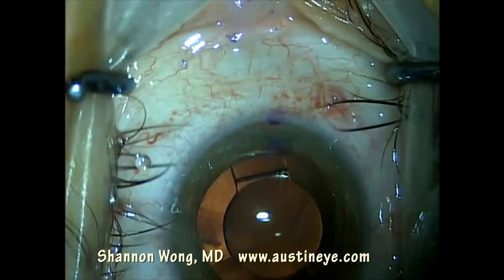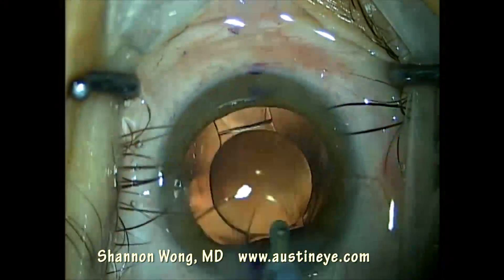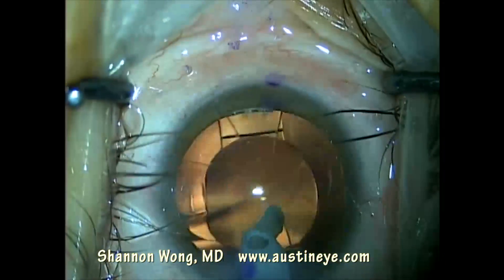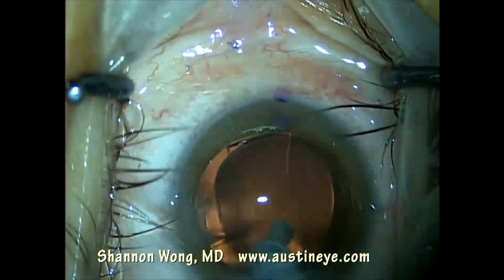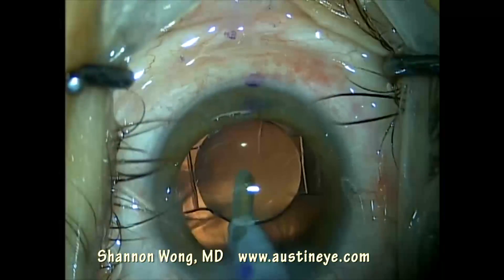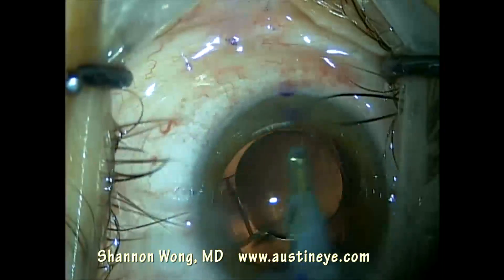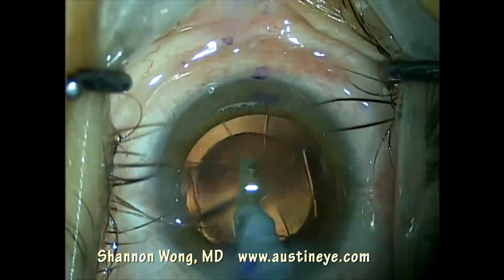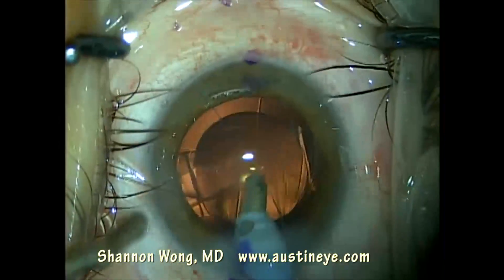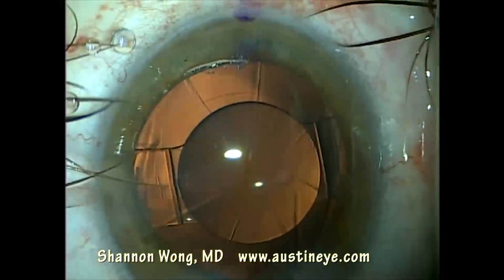Once we remove the IA tip, the anterior chamber shallows and the lens vaults more anteriorly. Here we're going underneath the optic of the CrystalLens to remove any viscoelastic which may be trapped behind the lens implant. It also helps us to remove any little cortical cells of the cataract that managed to find their way underneath the lens.